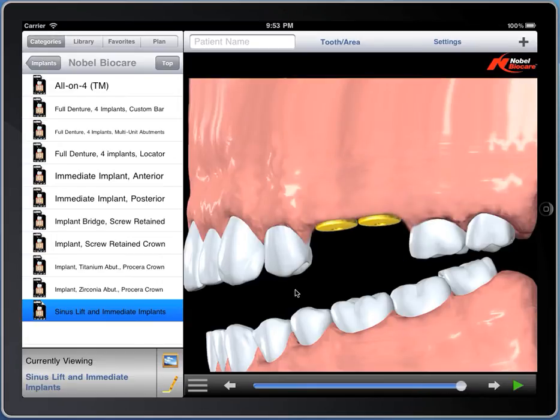So that's just a quick overview of the Nobel BioCare demonstrations in DDSGP. If there are any others you can think of that you'd like to see in the app, please feel free to email us. My name is Dr. Bob Marcus. Thank you very much.